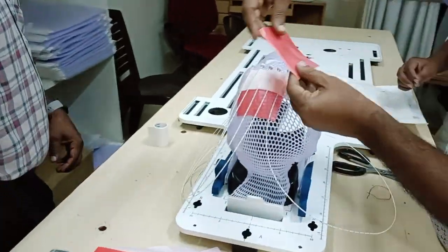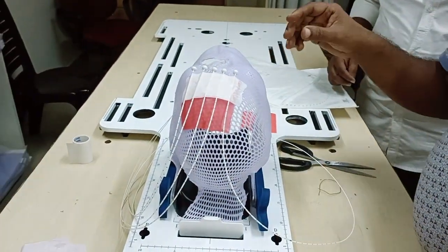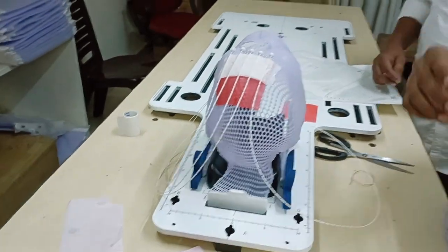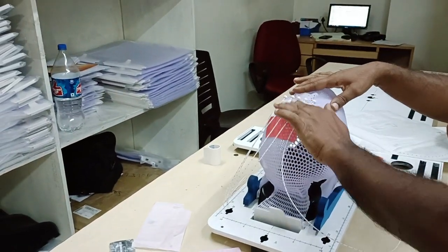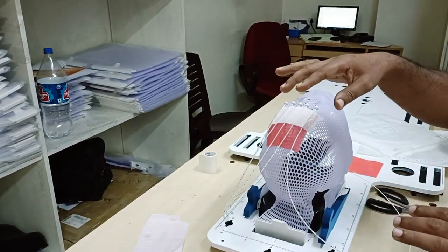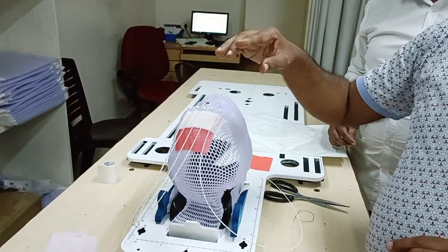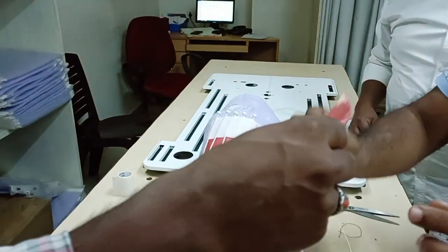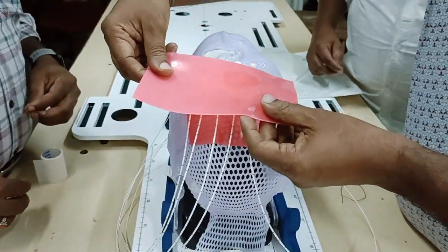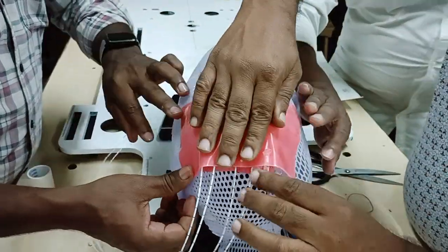Take a bigger sheet, melt it again, and put it up over the wires. Fix it in that part of the area to secure everything in place.